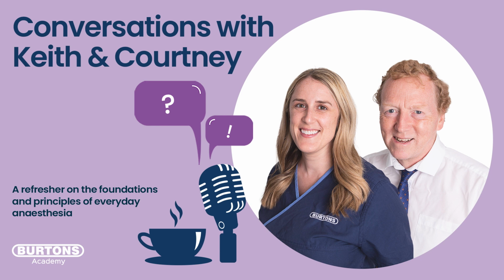Yes. So inevitably you deliver a volume into the patient, the chest is going to rise, the pressure is going to rise, and we're aiming for a target of, I said, 10 to start with. So we'd probably want to set a safety limit of maybe 15, 5 or 6 centimeters above what we're anticipating getting it to. And some machines will allow you to set that.